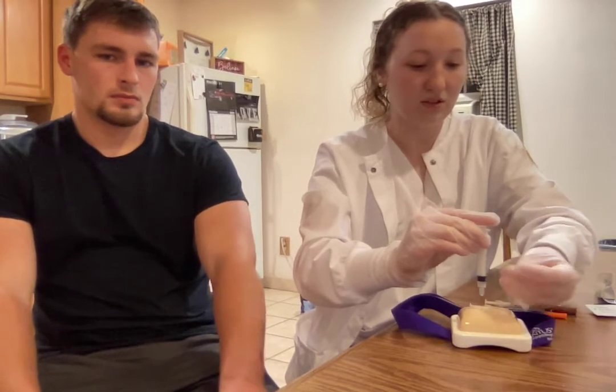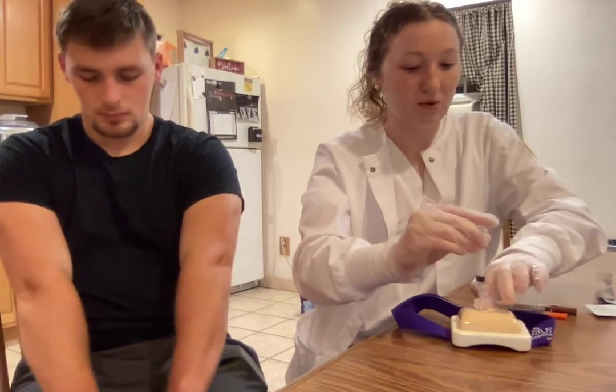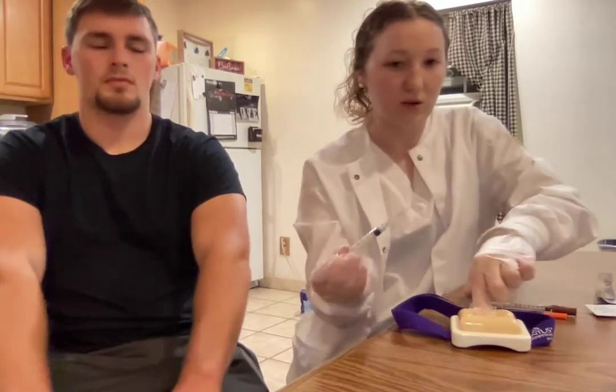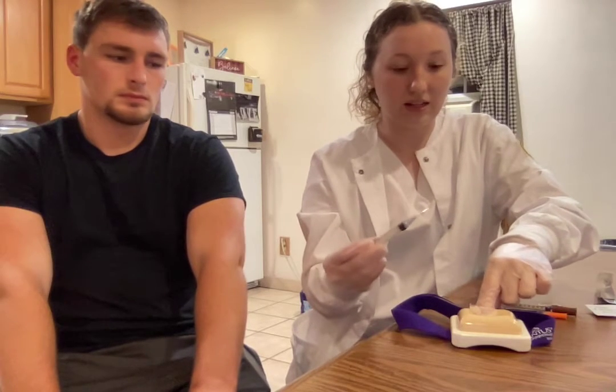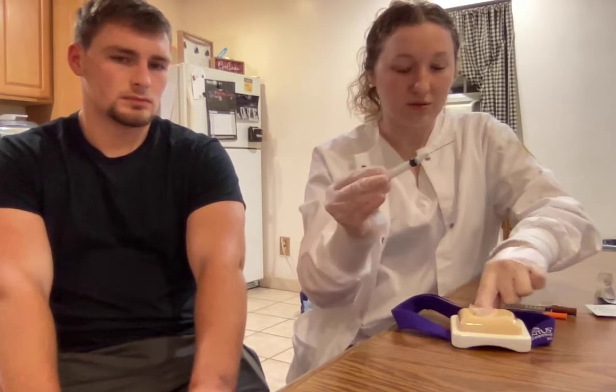And then I'm going to let go of their skin, and I'm going to take my prep pad and I'm going to hold pressure where I just inserted the needle, and then I'll have a bandage ready for them if they need it. And then this will go in the sharps container.